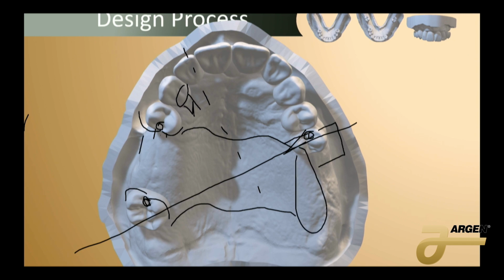So when you get into the actual clicking of the buttons, you want to keep in mind all of the minimum thicknesses of your whole frame. If you're getting into SLM printed or even milled, it's a little bit different than when we're casting wax. You cannot go below that 0.7 millimeters. So if that's your thinnest, if you want a flexible clasp, remember we said it has to be tapered, has to be thin, has to be non-uniform in shape. So if 0.7 is your thinnest point, then the top of your clasp should be a little bit wider than 0.7.